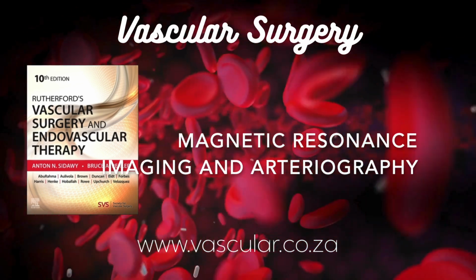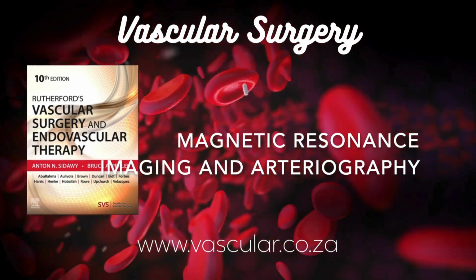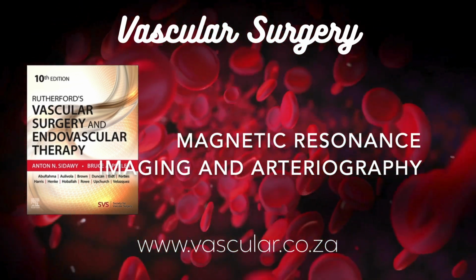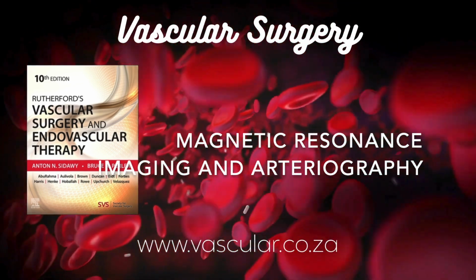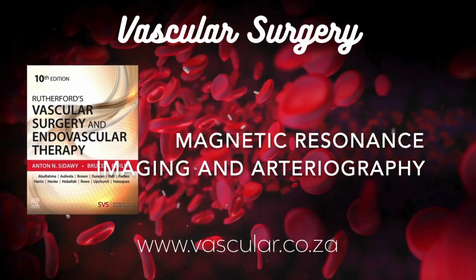Okay, shifting gears slightly, what about the practical stuff? Injecting contrast, monitoring the patient. Right. For contrast MRA, you need an MR-compatible power injector, usually a dual-chamber one. Why dual chamber? So you can inject the contrast agent rapidly, followed immediately by a saline flush from the second chamber. The saline pushes the contrast bolus through the vessels efficiently and can actually help reduce the total contrast dose needed. Smart. And patient monitoring.